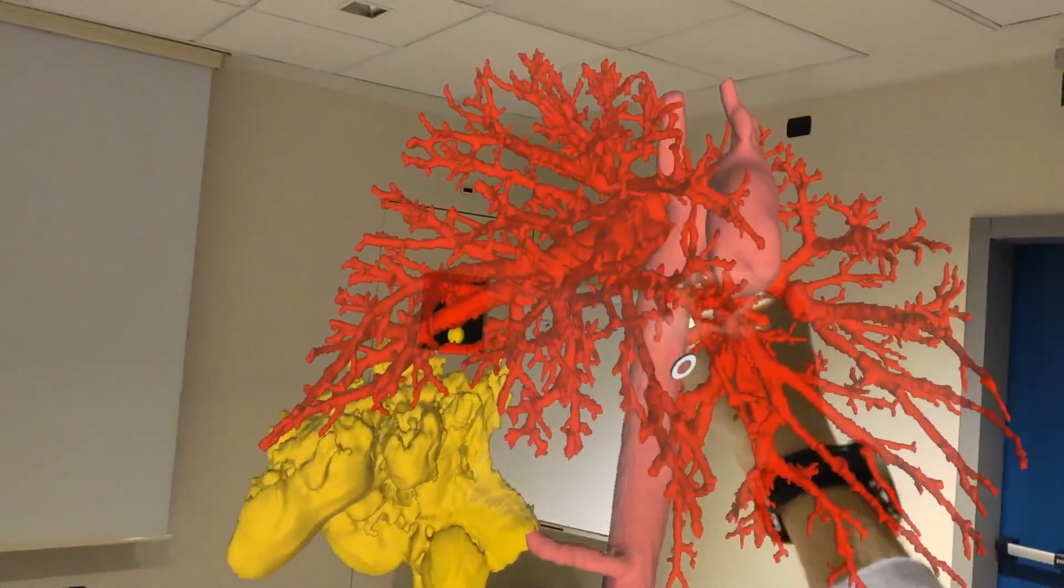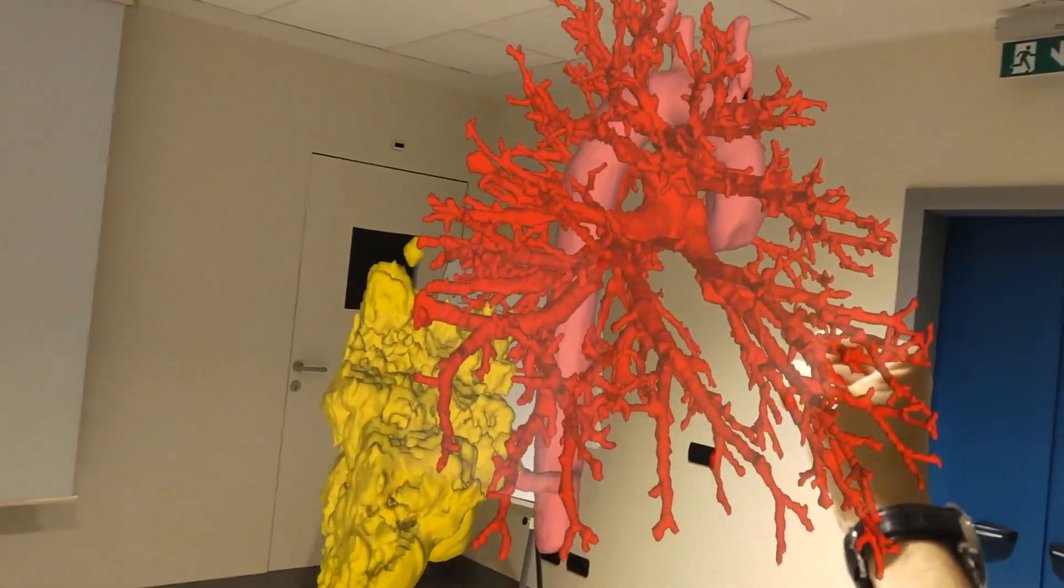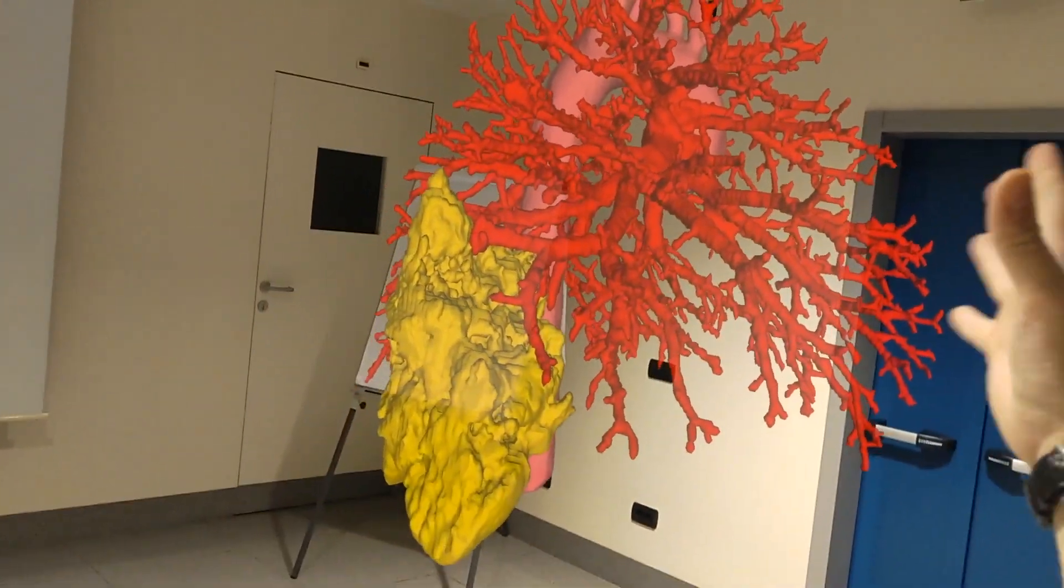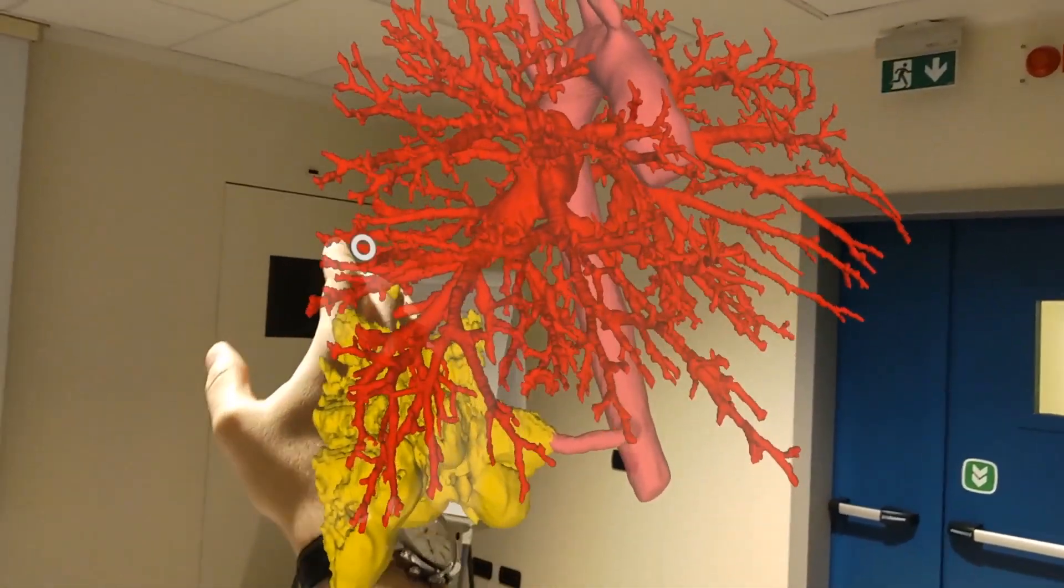You can clearly see the feeding artery from the aorta, pulmonary arteries here in red and veins in blue, as well as the whole tracheobronchial tree in light blue.